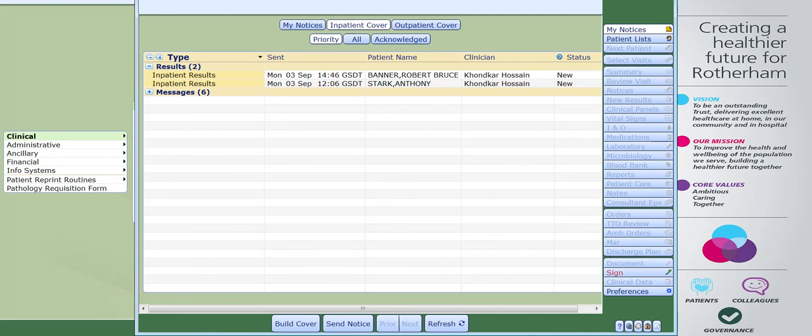Priority number two is urgent. These will be shown in yellow text — reports that are likely to require appropriate action, some of which will advise action within 24 hours. Priority three is routine. Routine reports will no longer be shown in this section but can be accessed via the report section for your patient.